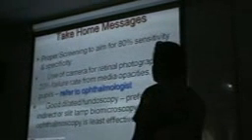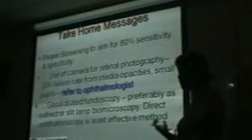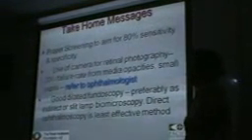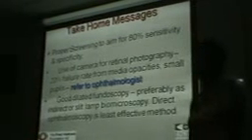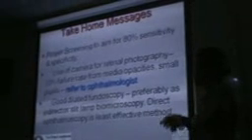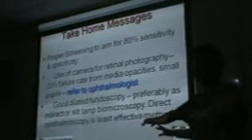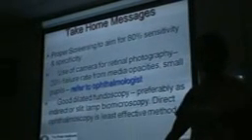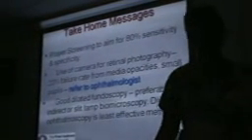And again, good dilated fundoscopy, if you don't have the camera. Preferably slit lamp indirect, but I suppose at primary healthcare level, you'll just use the direct ophthalmoscopy method. But remember, out of all those methods, it's the least effective. Okay? Thank you. That's our camera day.